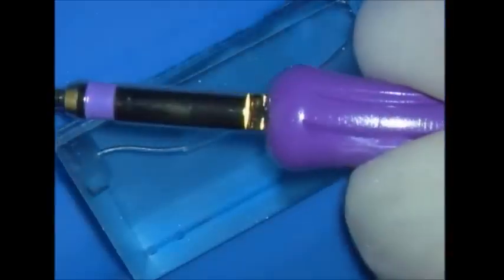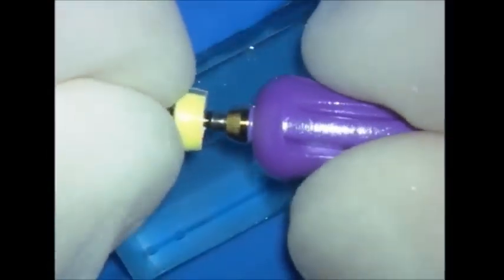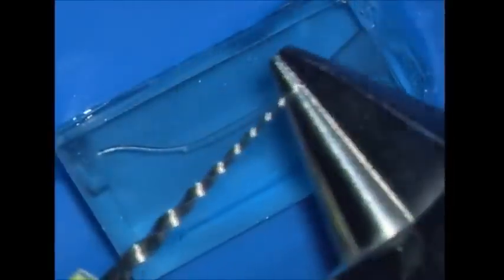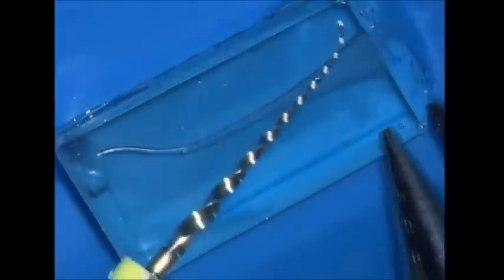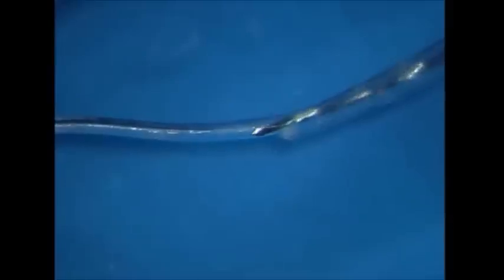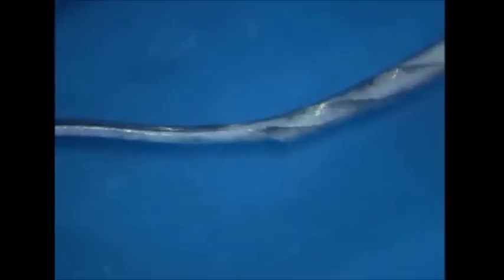As we saw earlier in the show, we can take a rotary ProTaper instrument and convert it to a manual file using the snap-on handle. A bird beak plier can be used to put a nice rolled radius curvature on the terminal extent of the instrument. By reciprocating the handle of the file, we can walk the tip of the instrument and bypass the ledge.